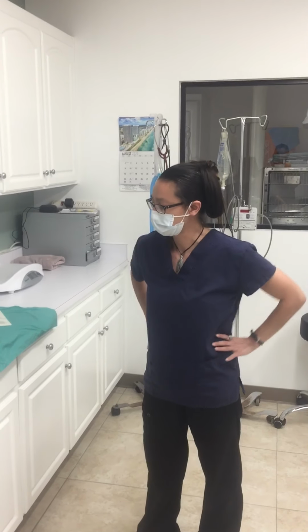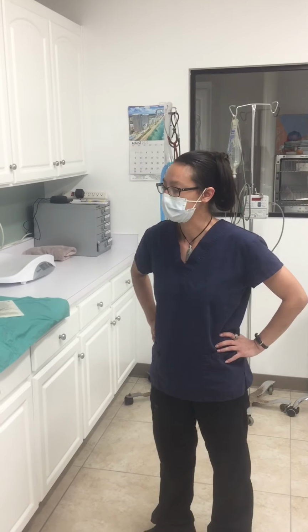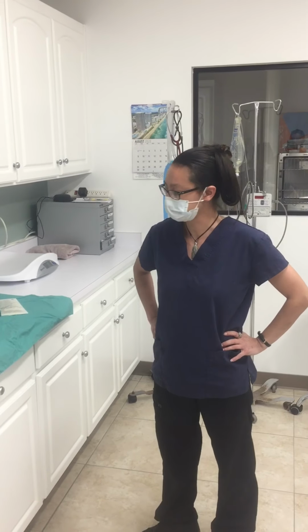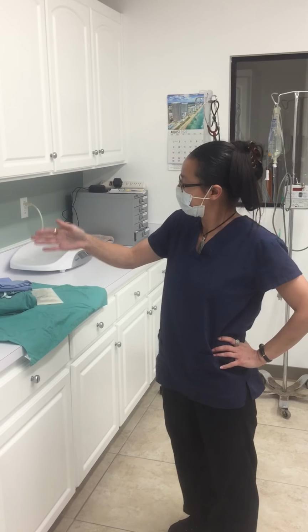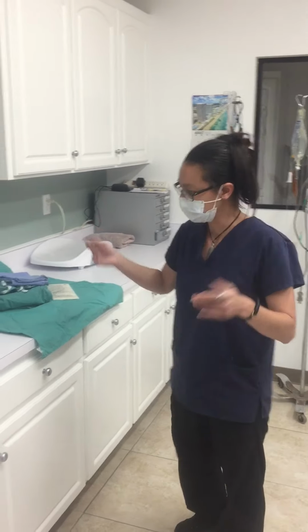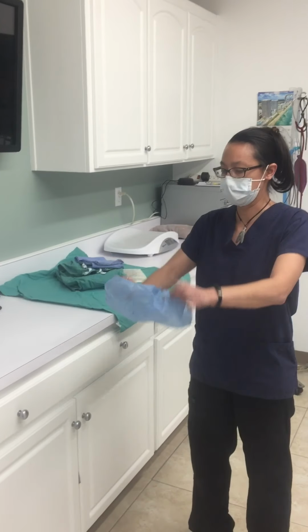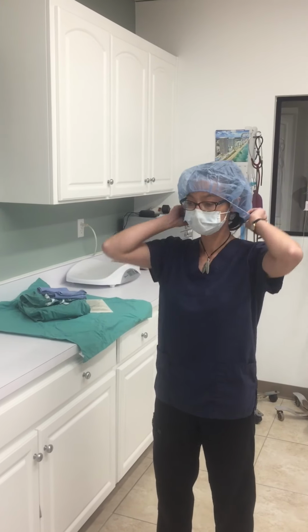All right, so we are preparing to scrub in for a sterile surgery. We're going to do it very basic. So we're going to go ahead and don our cap, our gown, and do a closed gloving procedure. First, we want to don our cap. This will go right over your head like this, covering all your hair.